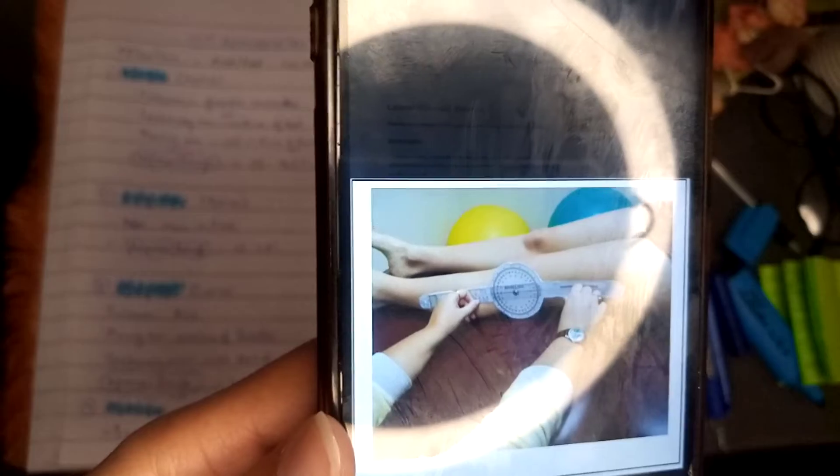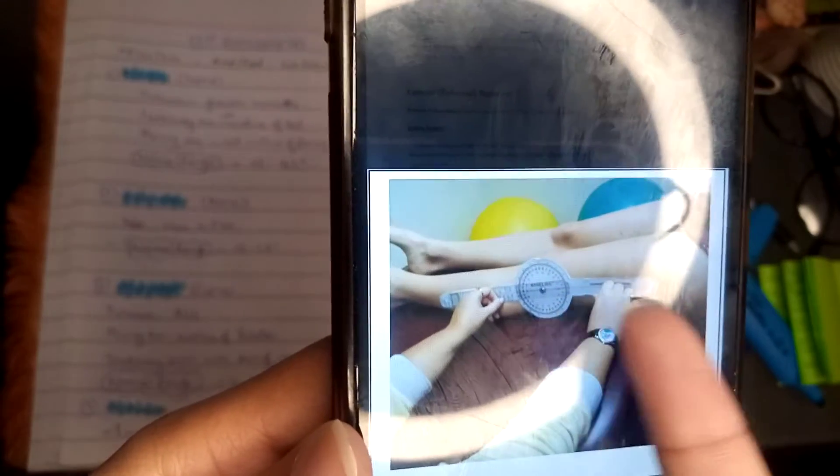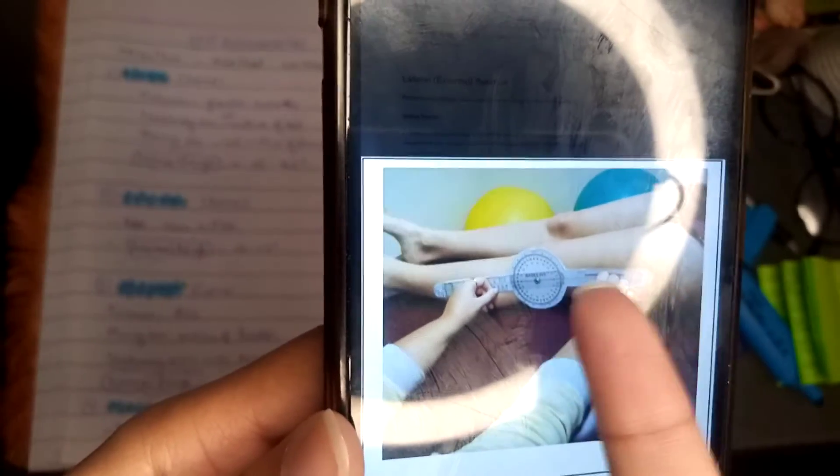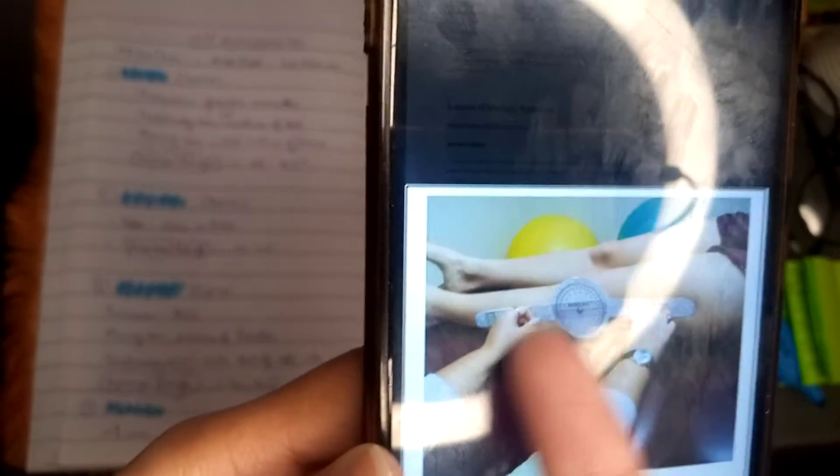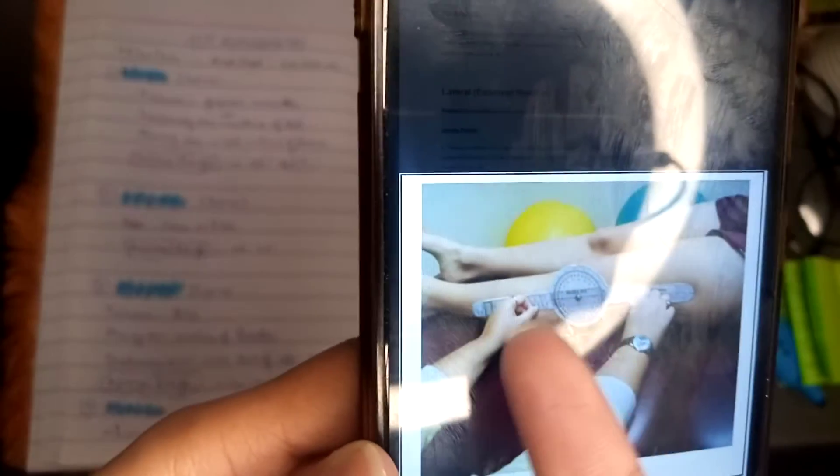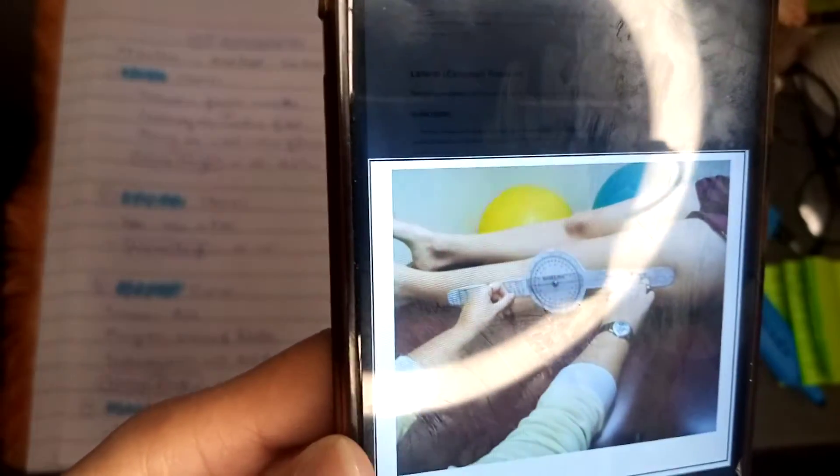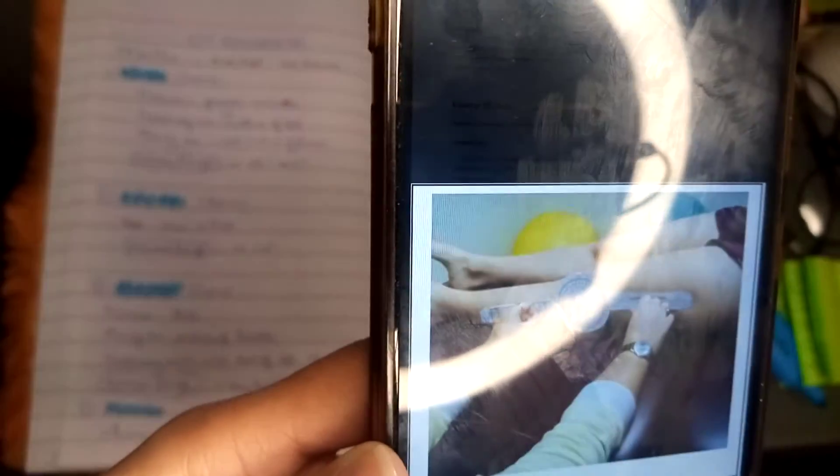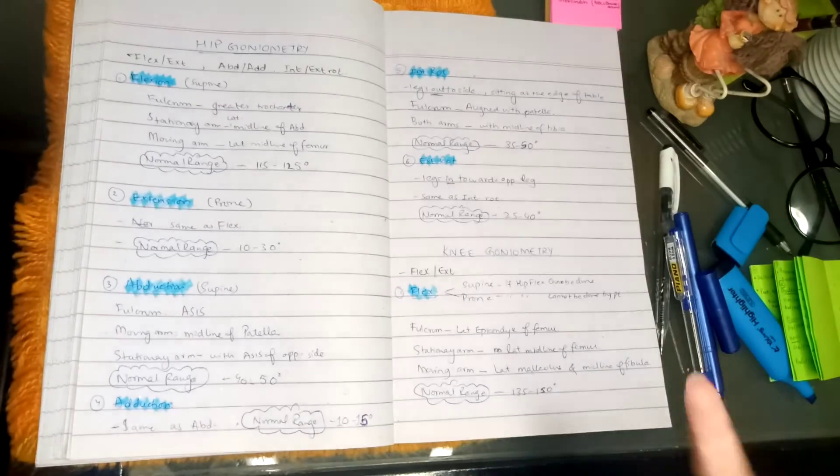We have the stationary arm that would be at the lateral midline of the femur, and the moving arm would be at the lateral malleolus. Here you can see lateral malleolus or midline of the fibula. This is the same thing. We can place the lateral malleolus or midline of the fibula.